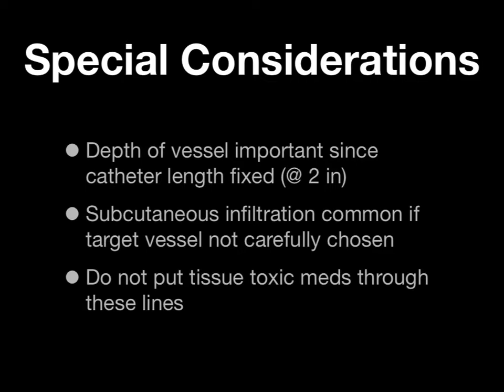The longest catheter that you're going to have access to, where you've got the angiocath over the needle, is usually about 1.88 inches to 2 inches in length. And the problem becomes, if you go after a target vessel that's relatively deep and you've only got a few millimeters of that needle tip in the vessel, any movement of that arm is going to lead to the catheter being pulled back and losing your desired placement.